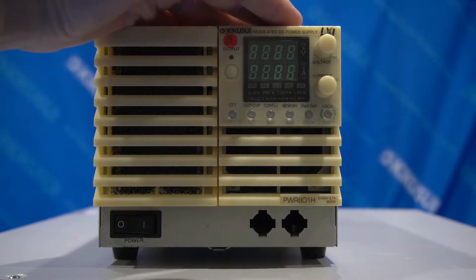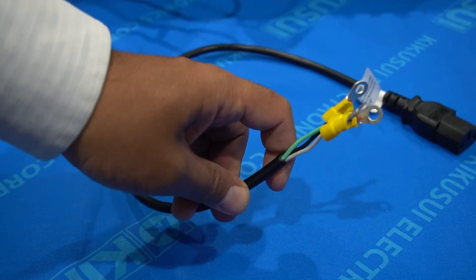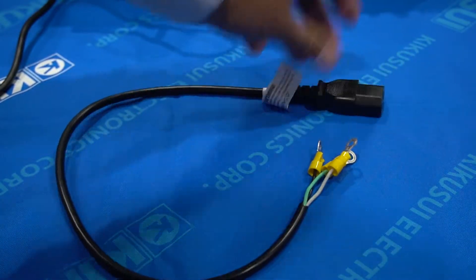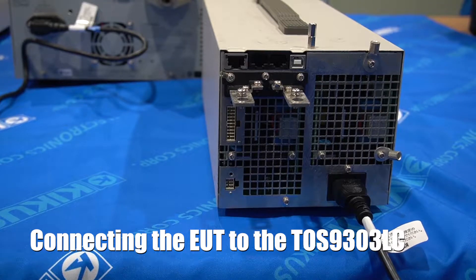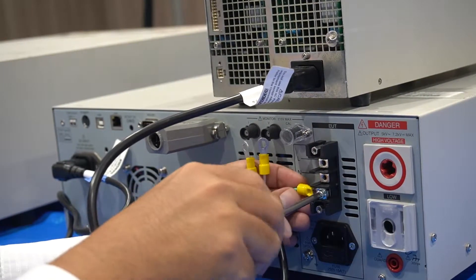This is the EUT we are going to use for the leakage current test. We'll use this type of cable to connect the TOS9303LC to the EUT. Connect the EUT's power cord to the AC line-out terminal block on the rear panel. Firmly connect the power cord to the EUT.